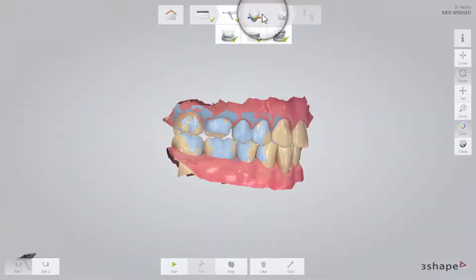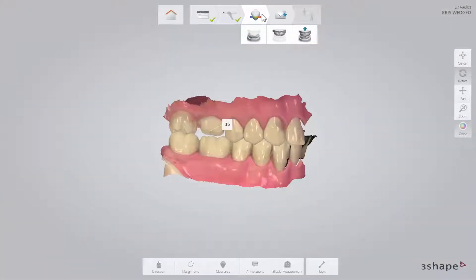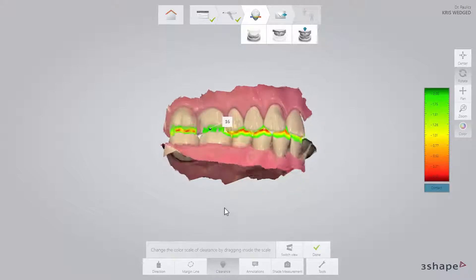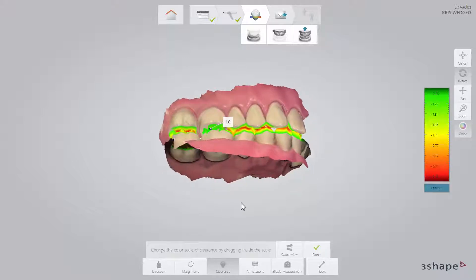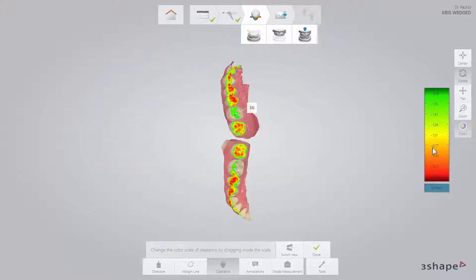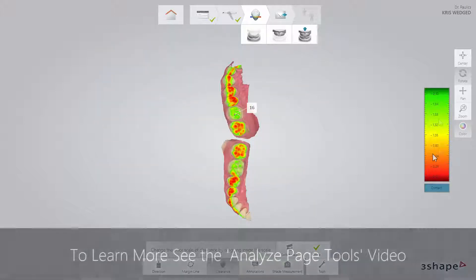Go to the Validation page and confirm that there is enough space for the reconstruction between the upper and lower arches using the clearance tool. Optionally, you can set the margin line. You can also add comments on the 3D scan using the annotation tool. To learn more, see the TRIOS Analyze Page Tools video.